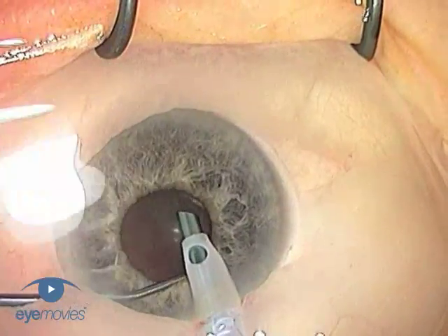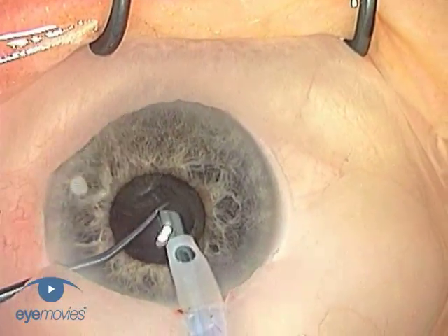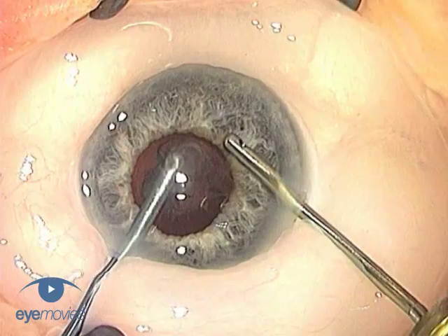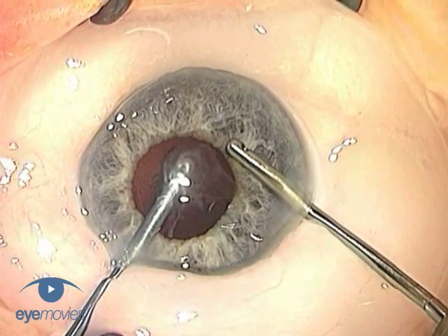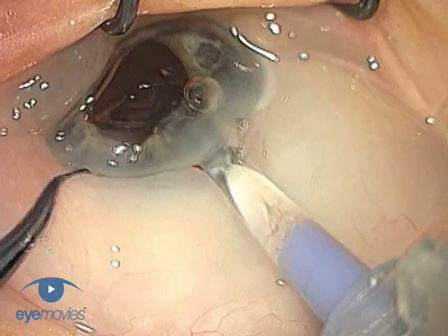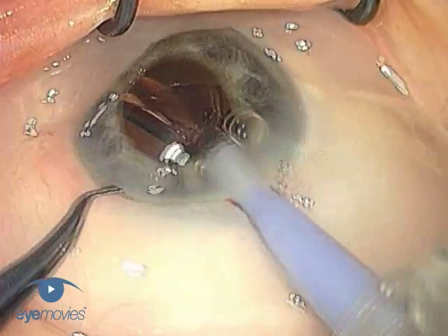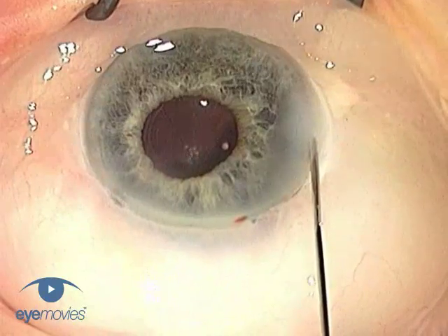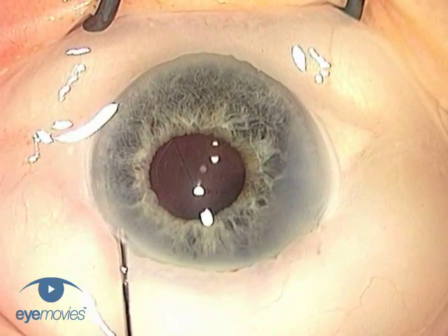When confronted with this, an inexperienced ophthalmologist may just battle onwards, not quite realising that this relatively trivial phenomenon may make the operation much more difficult and risky. We'll show you the importance of dealing with chemosis, as well as demonstrating our preferred technique for dealing with this troublesome but potentially serious complication.